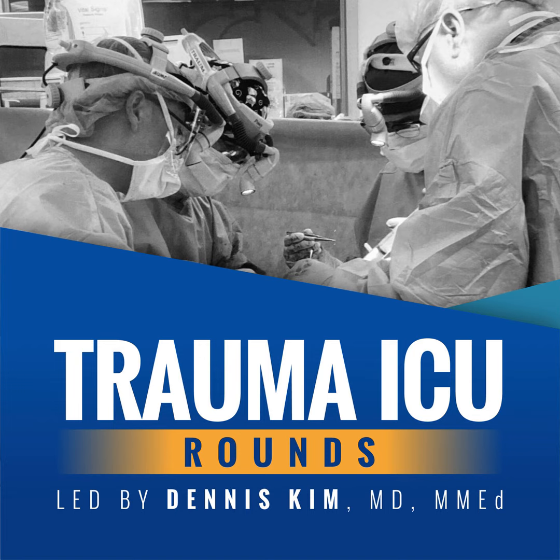But having assessed our mechanically ventilated patient and making the determination that they, in fact, are now ready for an SBT, the next assessment we want to perform is, are they tolerating the SBT? Which brings us to the second objective for today's rounds, namely to describe commonly used weaning parameters that may assist us in determining the likelihood of success or failure during a spontaneous breathing trial.